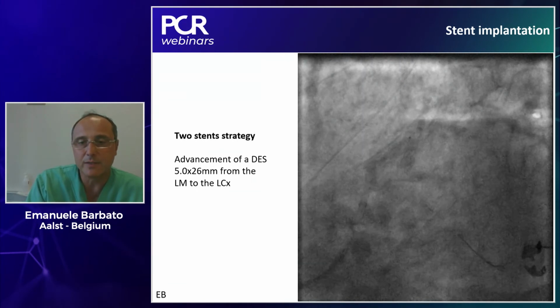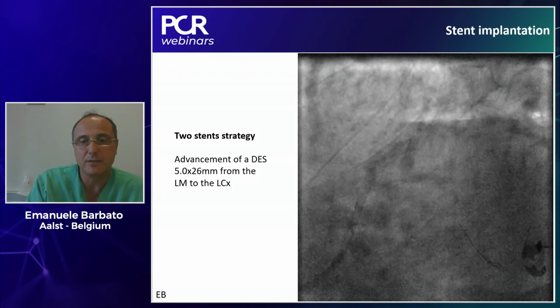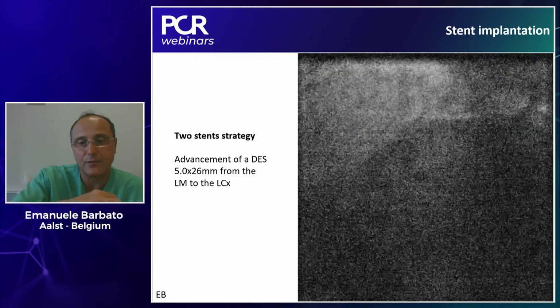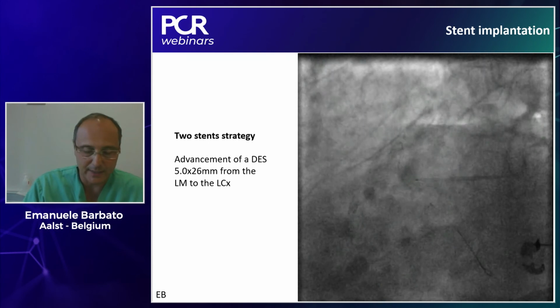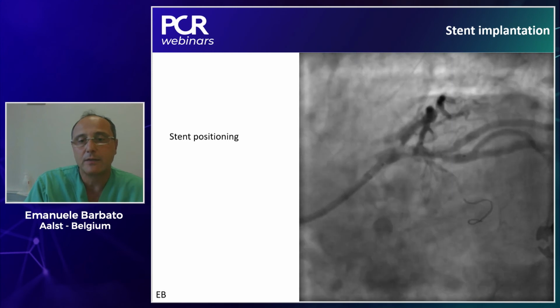We know from the EBC left main trial that in 20-30% of the cases, a two-stent strategy was applied down the road, after having started with a provisional stenting strategy with a beautiful result. That is what I would do in this case, perhaps ending up with a TAP technique.